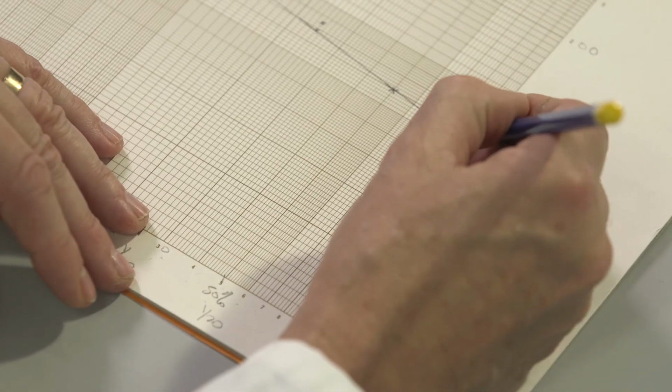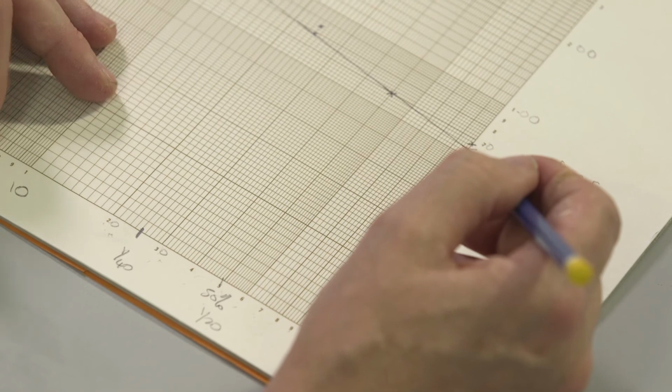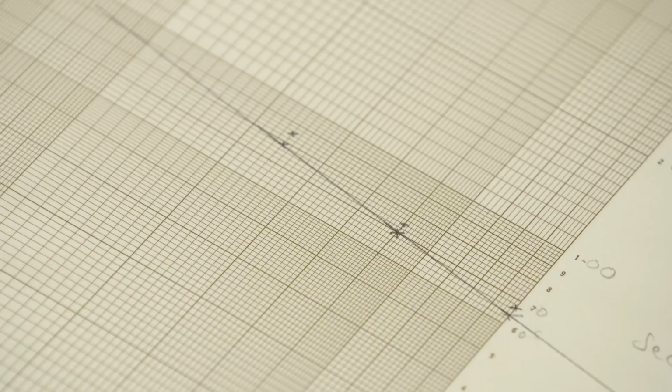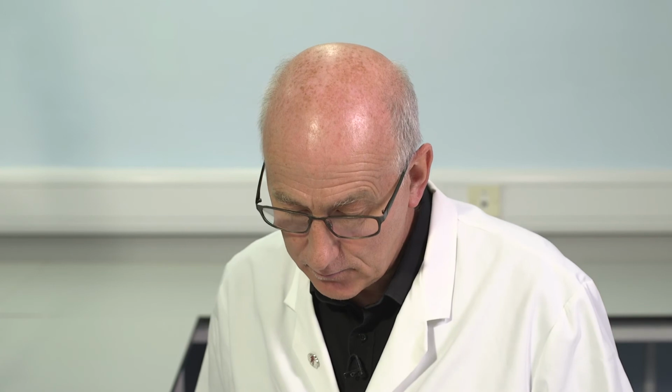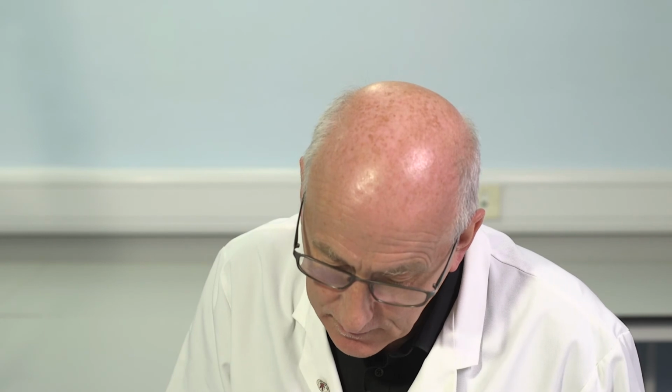Clotting time, 67 seconds. 1 in 20 dilution, again plotted in the same line. 10 over 20 times 100, 50%, 50% line. 73.4 seconds, just under the 74-second gradation. 1 in 40 dilution, IQC sample, 86 seconds. So 1 in 40 in the same plane, 86 seconds.